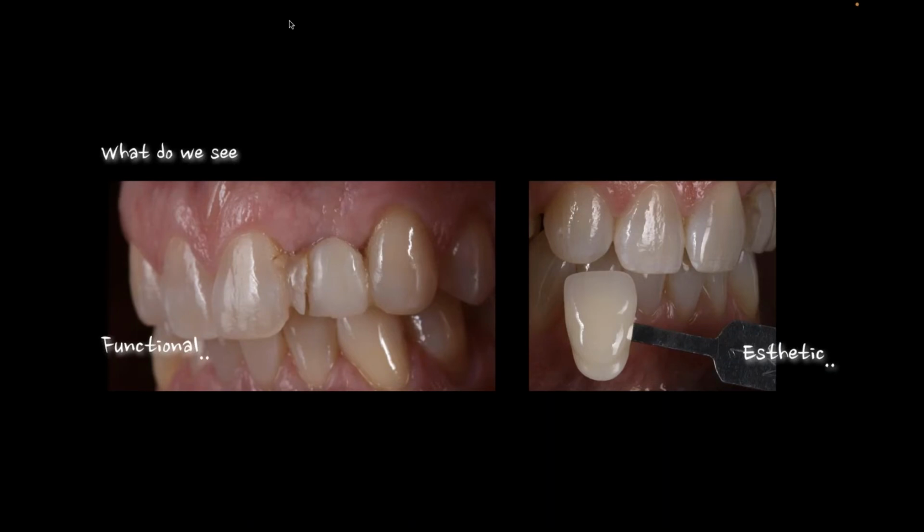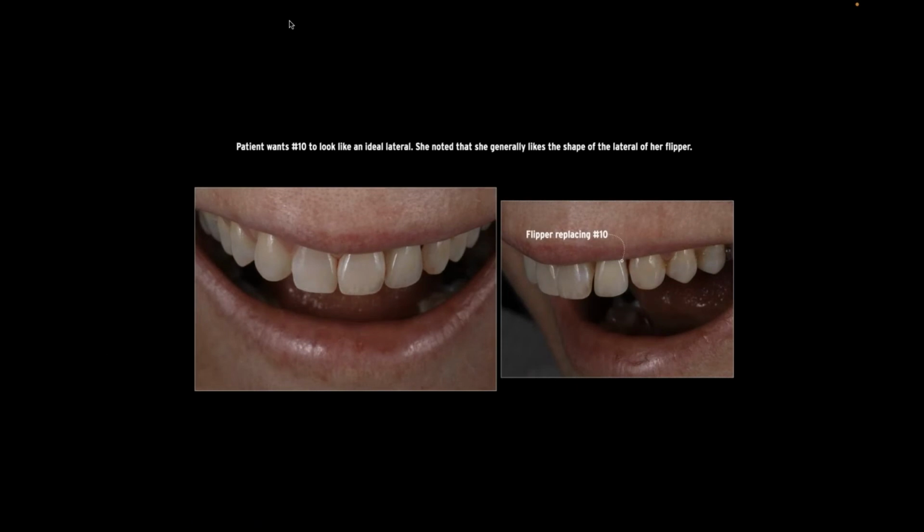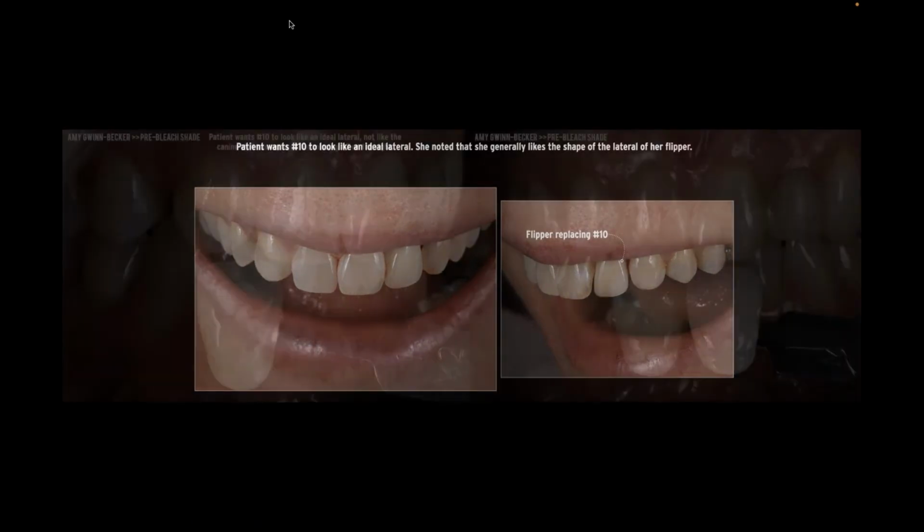I'm actually going the opposite way, and I'm looking at the contralateral side, and I'm looking at the surface topography, what enamel is really on that tooth, and is it milky, translucent, or transparent? What enamel do I have to work with? And once I know that, now I can start looking at the reference points for what I want to do to pick the actual tooth color, because that enamel choice is going to affect how I see the tooth.